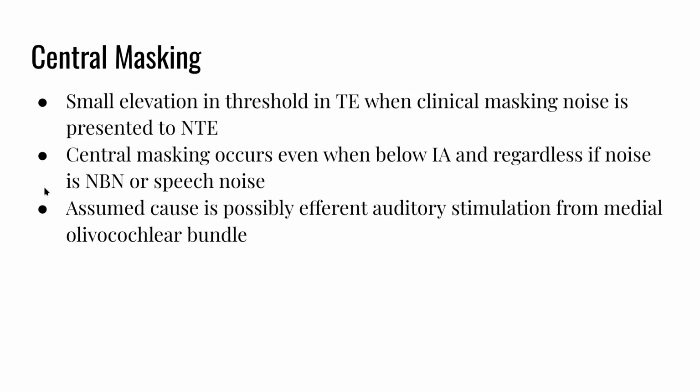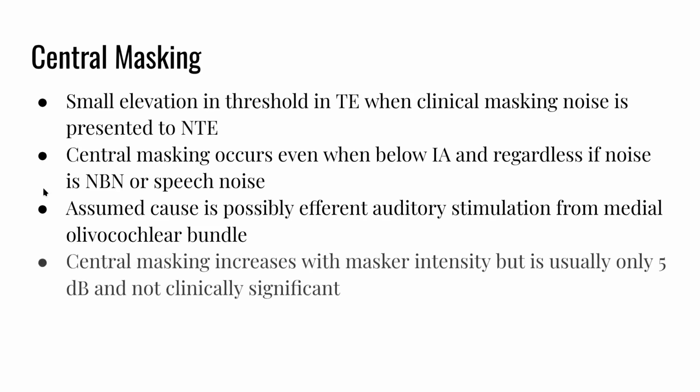It's one way you can measure the efferent function of an individual. It's not typically a clinical test. It's done more in research related to hearing and noise. Central masking increases with masker intensity, but it's usually only about 5 dB and not clinically significant.